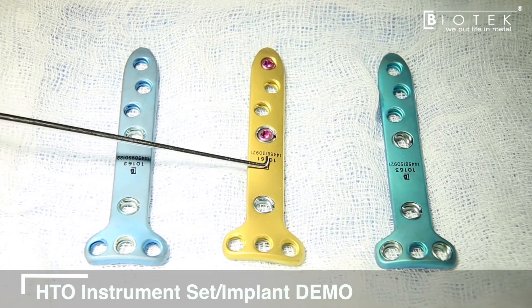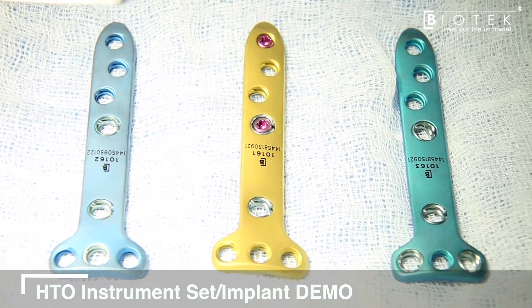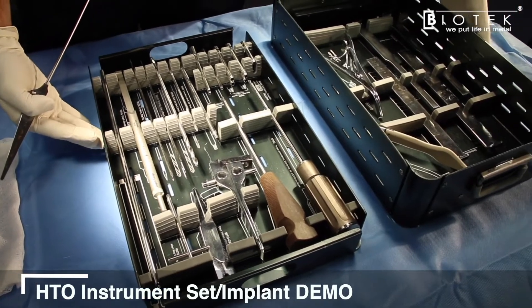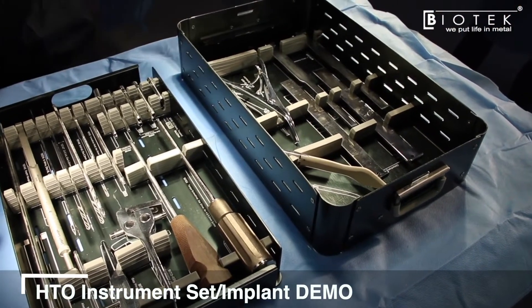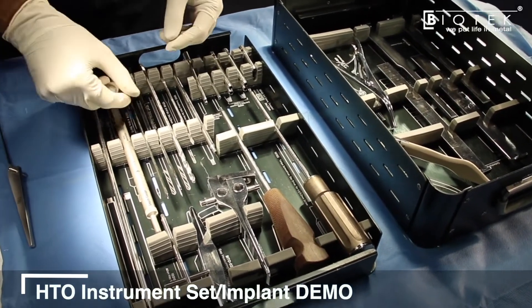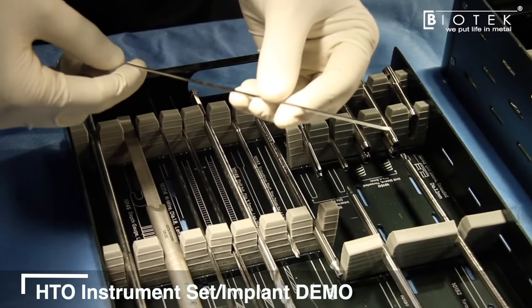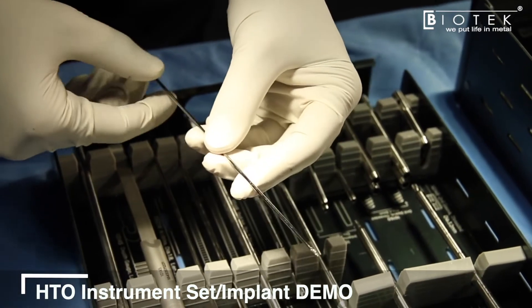This is the Biofix NP plate system — three plates for a high tibial osteotomy only, for HTO with ACL reconstruction, and for HTO with medial meniscus posterior root repair. Coming to the instrumentation system, first we have trocar tip guide wires to help place guide wires at the required angle and site of the osteotomy.